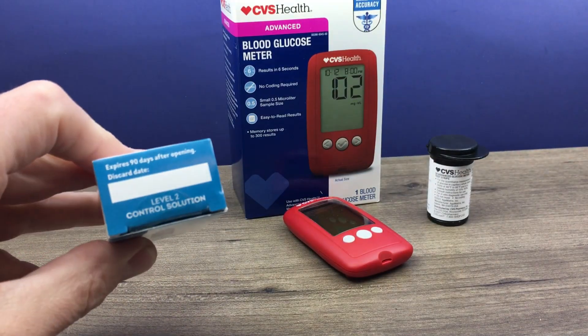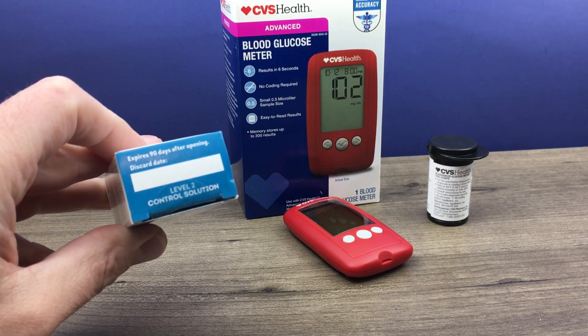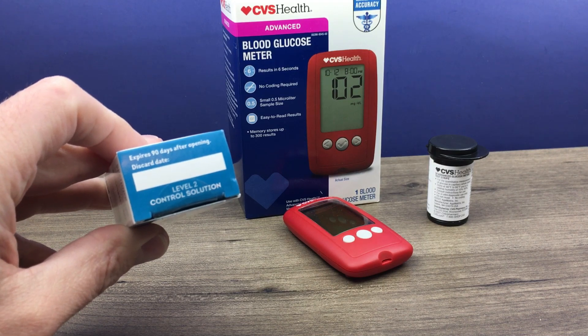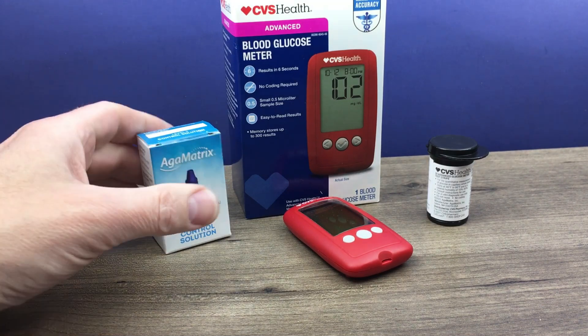Now keep in mind, once you do start using the control solution it's only good for 90 days. So you want to write a date 90 days from the first date that you use it so you know when that control solution should be discarded.